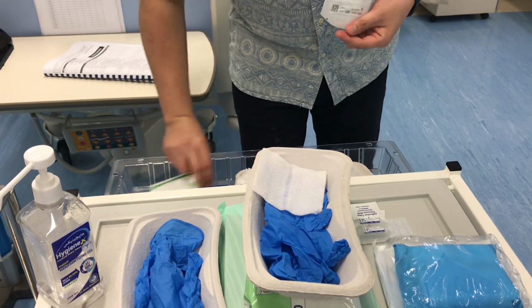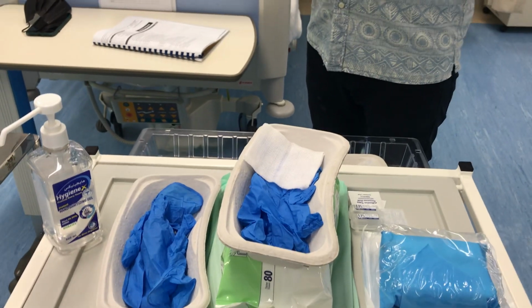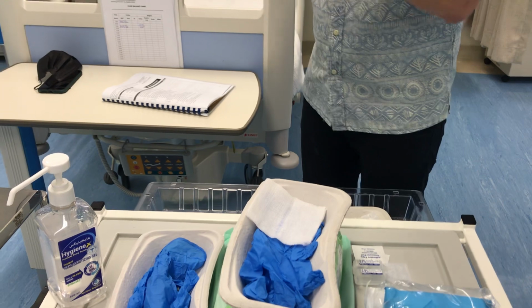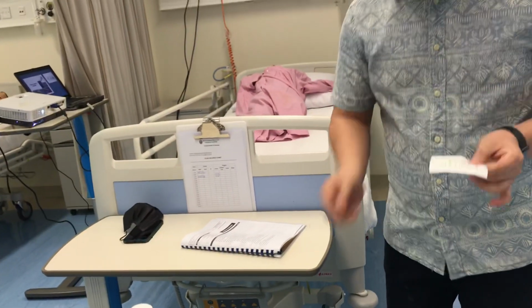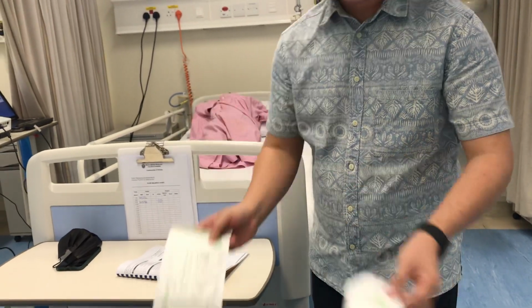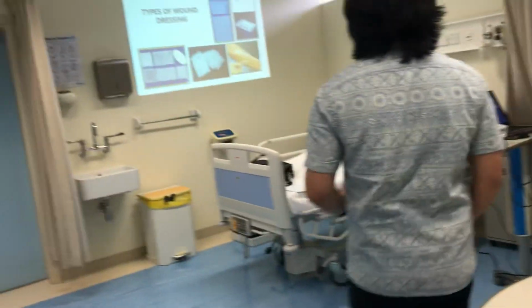Okay. But let them understand that aside from this wound dressing that we have, there are also several commercially prepared wound dressings. Some have impregnated medication on them. Some are made up of charcoal. Some are transparent, etc. Okay? But basically what we have in the lab is the ordinary wound dressing that we have. Simple there. Okay?